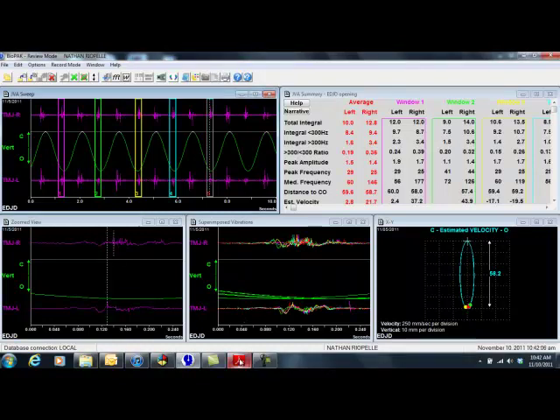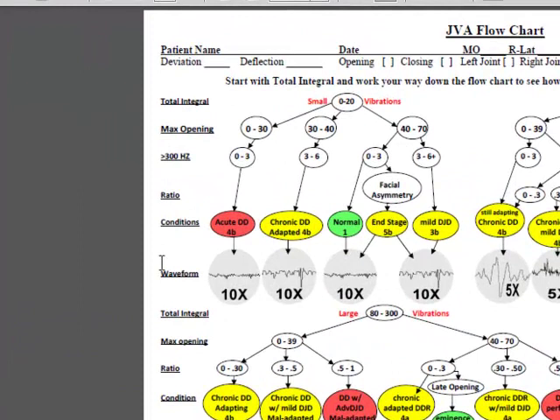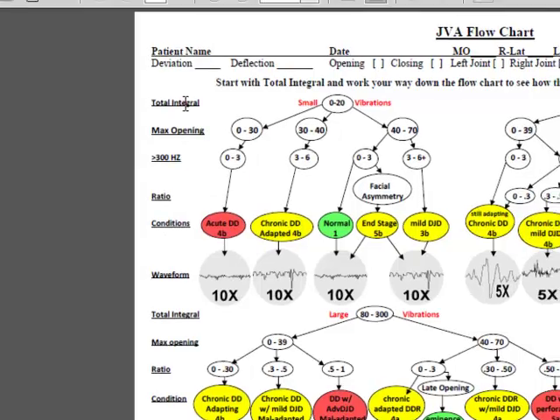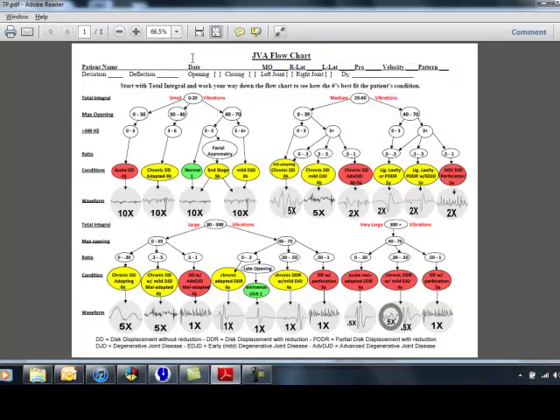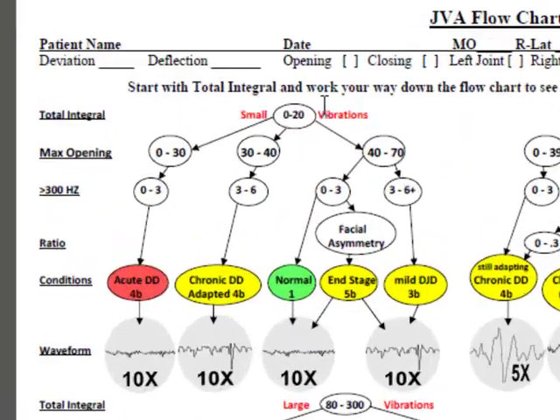Looking at the JVA flowchart, we are going to read it from top to bottom. We will look first at our total integral number. In this case, in my right joint it is 12.8, so that would put me between 0 and 20.